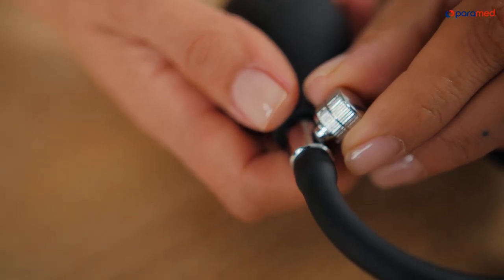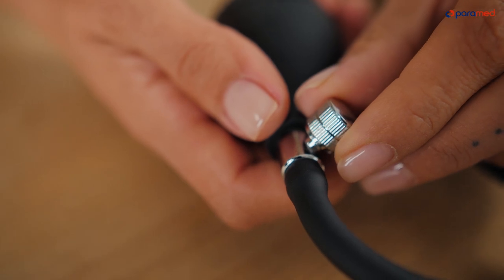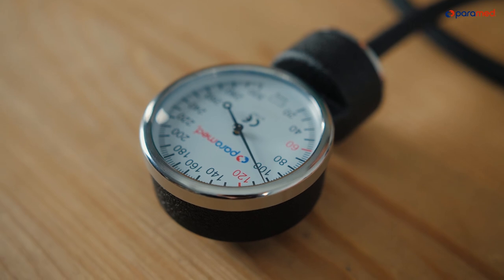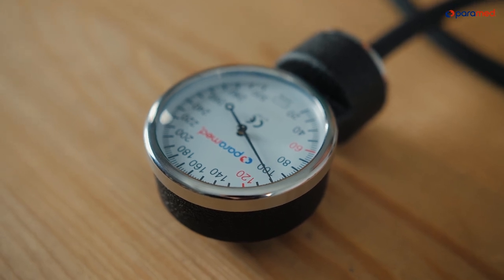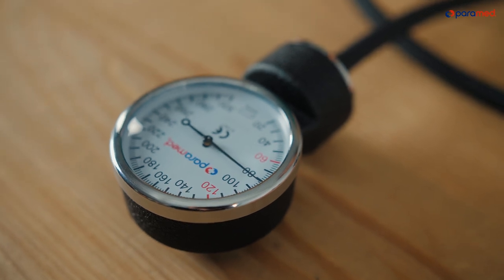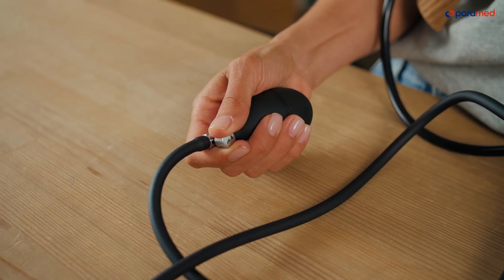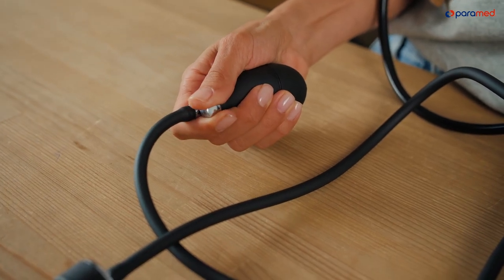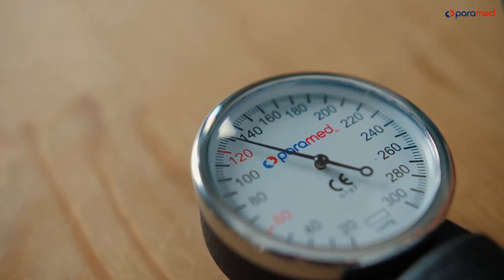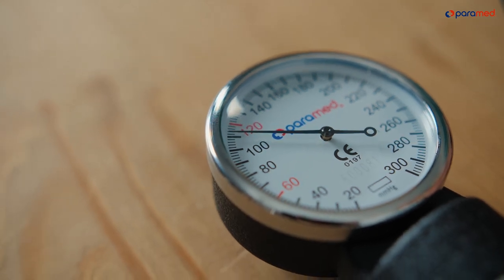Start letting air out of the cuff so that the manometer's arrow descends 2 to 3 marks per second. At the same time, listen to your heartbeat using the stethoscope. When your heart beats, the arrow usually makes a short, abrupt jump. Note the pressure when you first hear your heartbeat — this is the upper, or systolic, pressure number. Note the pressure when the sound stops — this is the lower, or diastolic, pressure number. Then release the rest of the air from the cuff.